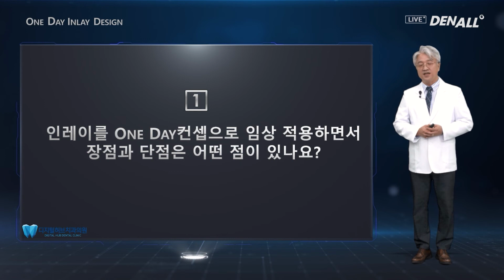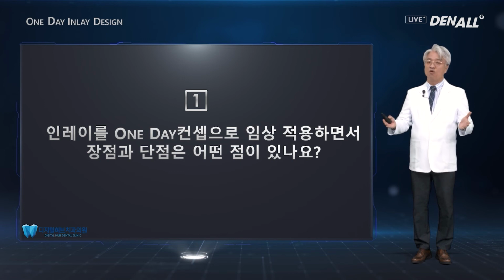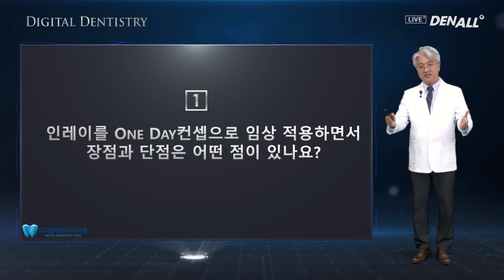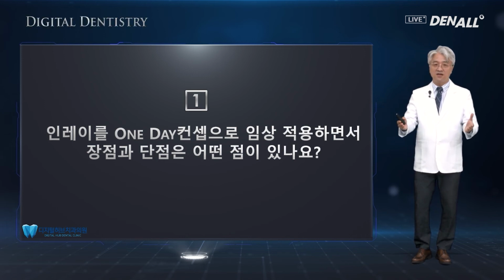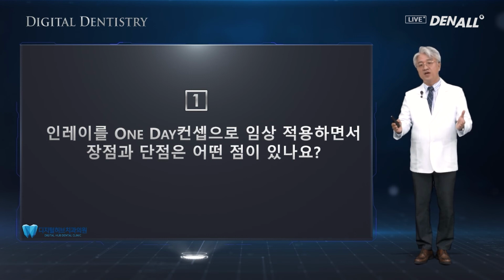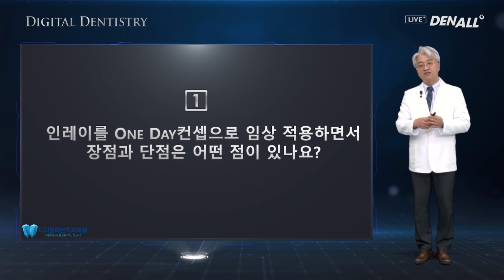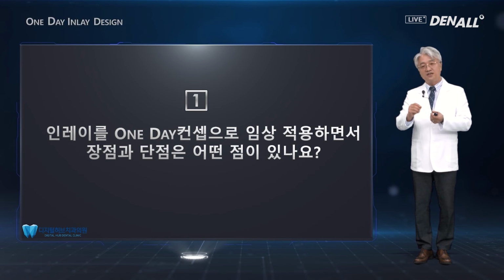attractive. All the more with the adoption of CAD-CAM system, with the CAD-CAM software, 3D printer, and oral scanners advancements, compared to when you had to do it analogly, like you have to do rubber impression, you have to do stone work, and in CAD you do design, but in actual inlay, manually you have to make the inlay, which takes a lot of time and effort.